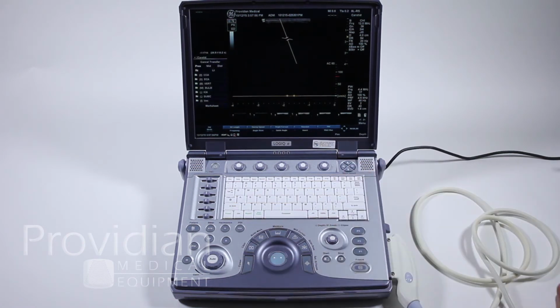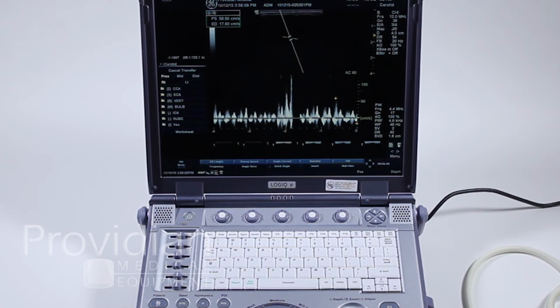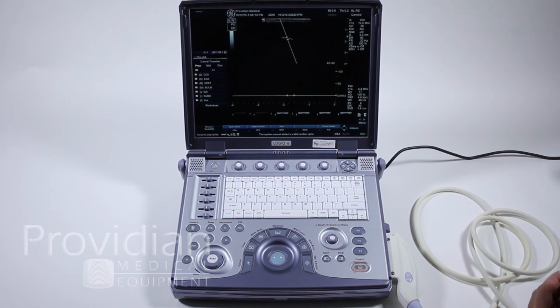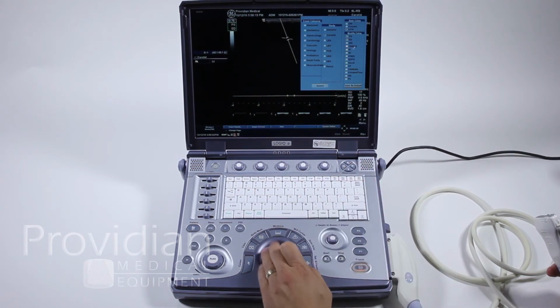Live will show me the active measurements. And it will follow as you go along. I'm just tapping my hand on the probe to give an example of how the auto calcs are working. You can also, if you don't like the way that's showing up, do it in frozen mode, again by clicking here and choosing frozen.